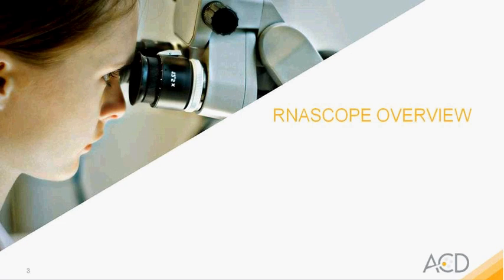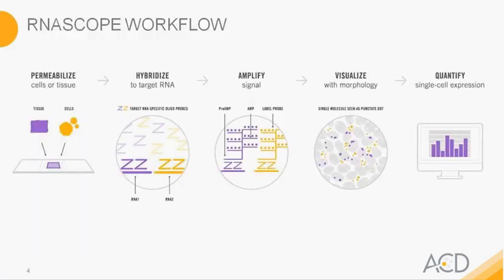So for the next segment, I will be reviewing RNAscope technology. The RNAscope workflow has various steps, and I'll walk you through the workflow from left to right, as in the slide. The first step is permeabilization of cells or tissue. Tissues are typically already fixed on slides and are permeabilized through pretreatment to access the target RNA.